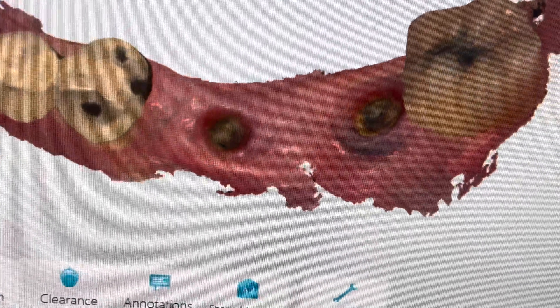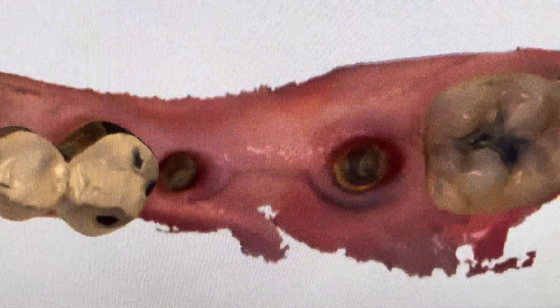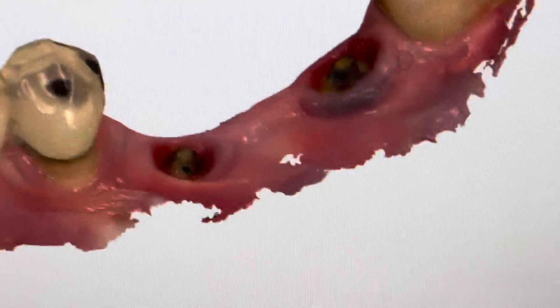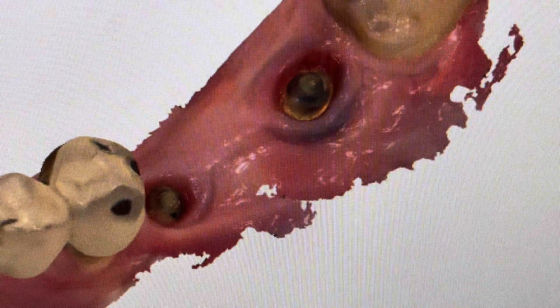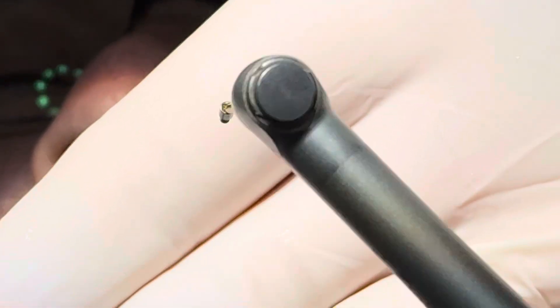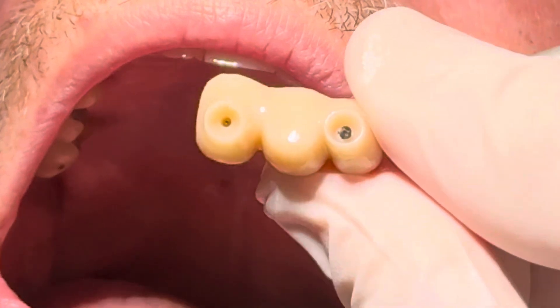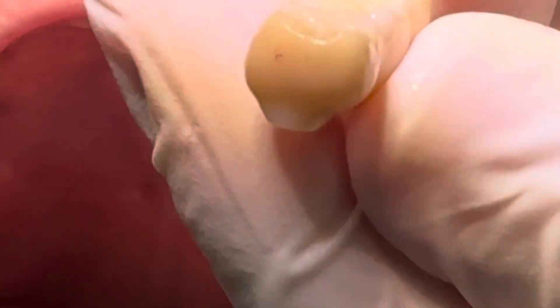Visualize the area — you now have multi-units sitting on implants with a platform shift four millimeters underneath the tissue. This allows you to put the bridge in and achieve that biologic seal. You can actually see that here in the red tissue that's bleeding slightly. The screw is very easy to put in and can be carried to the patient's mouth and tightened down quickly and easily.